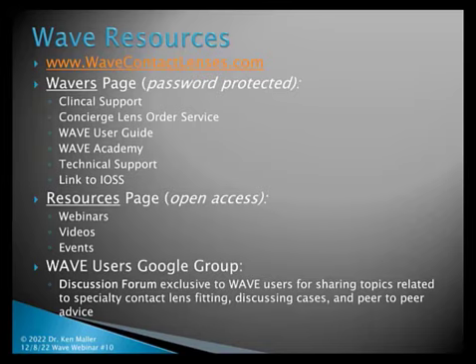The other thing also, I did demonstrate tonight how the modification area works, but that's actually not the only way to make these modifications. In fact, on that very last patient, patient number 3, that I showed you all those modifications, I actually did them manually. I did not use the modification area. I really did that for this webinar so that you can see how easy it is to do. Because I've been utilizing Wave software for so many years, I'm very comfortable making manual changes and seeing how all of those changes are applied to the lens as I move forward.